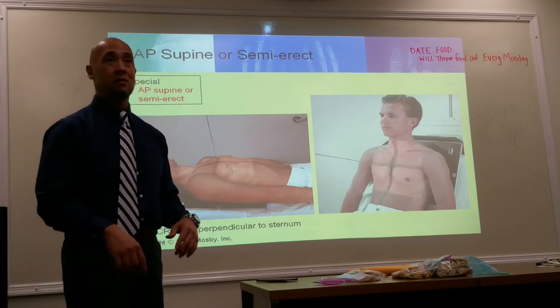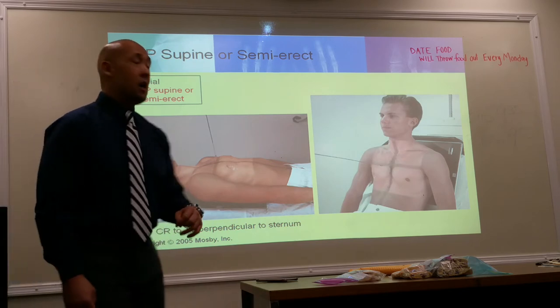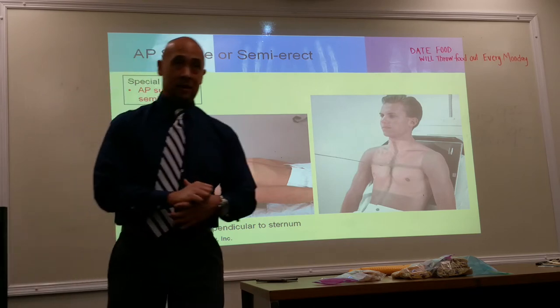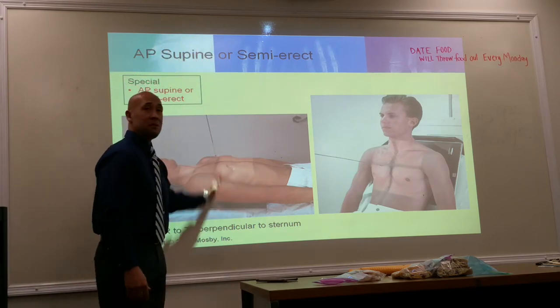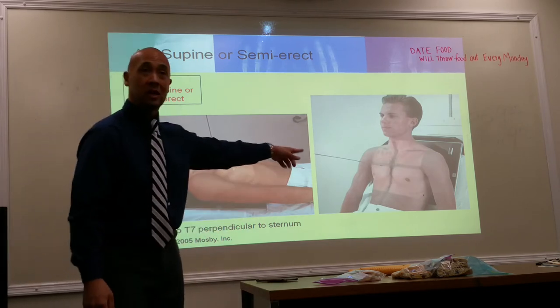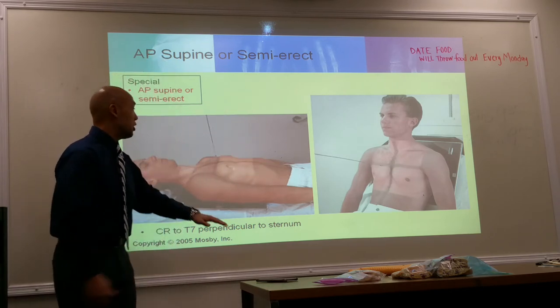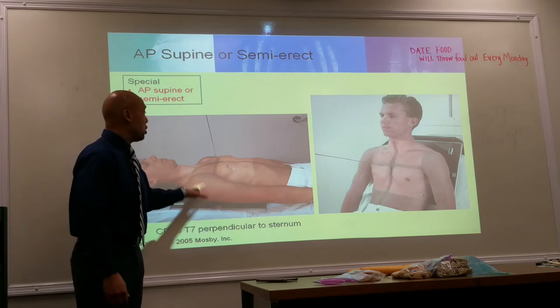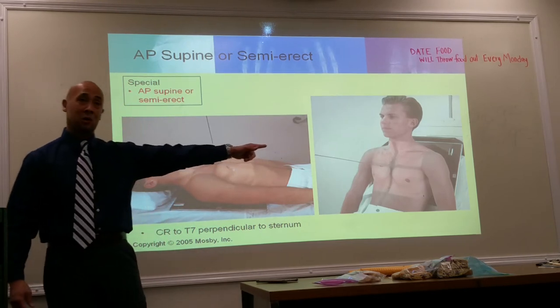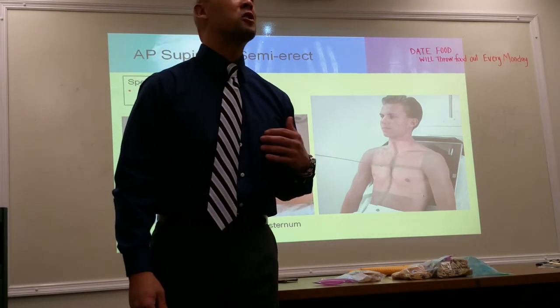They gotta match up. Is it axial projection or is it perpendicular? Pardon me? Is it an axial projection? Okay. Question was, is it an axial projection? So I was just gonna talk about that. Your X-ray tube is not gonna be perpendicular to the image receptor, which is one of the biggest mistakes of doing portable X-rays like this. Okay? It's not perpendicular to the image receptor. When you are doing an AP, okay, any AP, whether supine or semi-erect like so, your center ray is going to be perpendicular to your sternum.